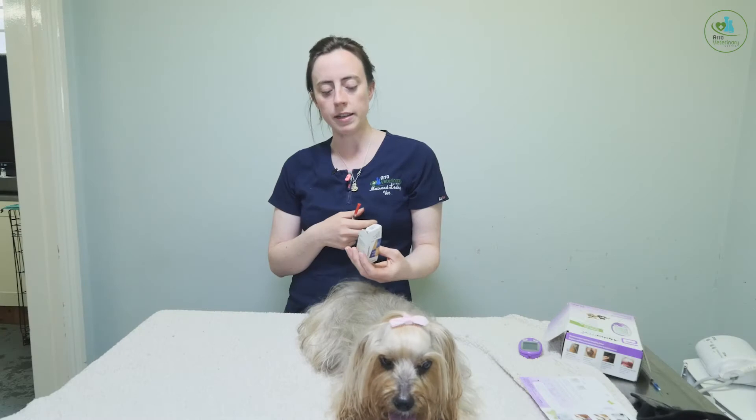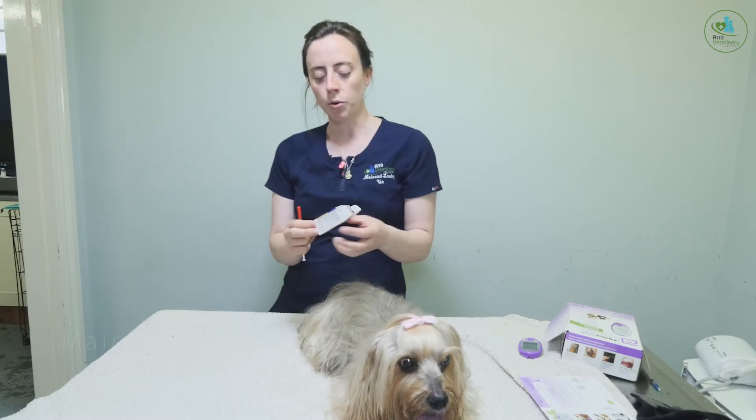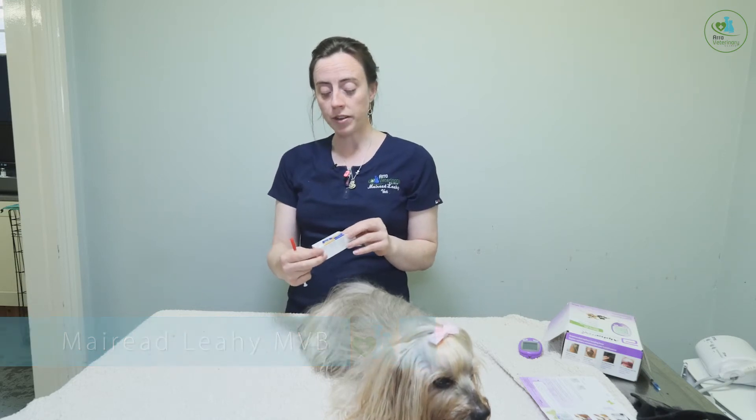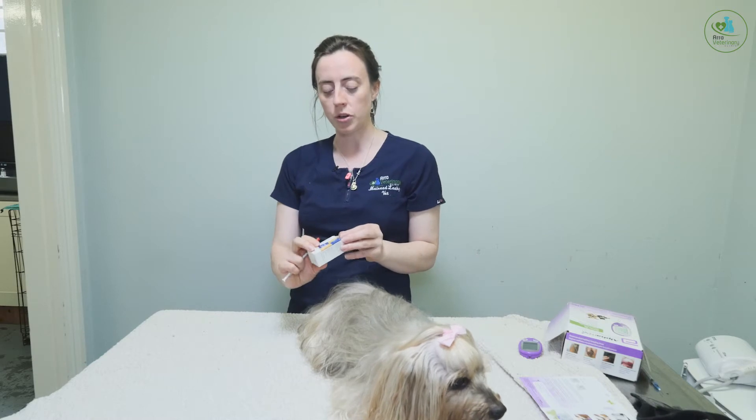This is just to demonstrate how to give an insulin injection correctly. So this is our insulin here. When your dog is diagnosed with diabetes, your vet or the vet nurse will go through everything with you, but this is just a handy reference point to look back on.